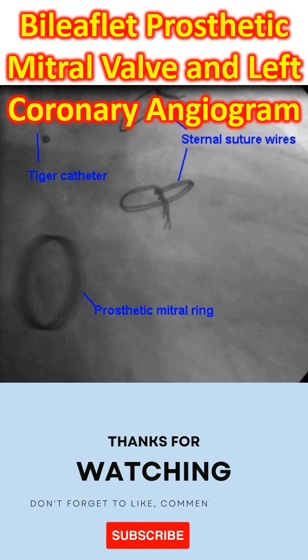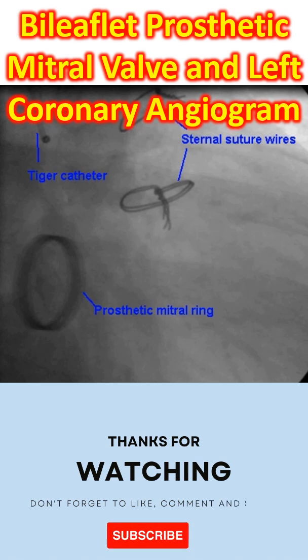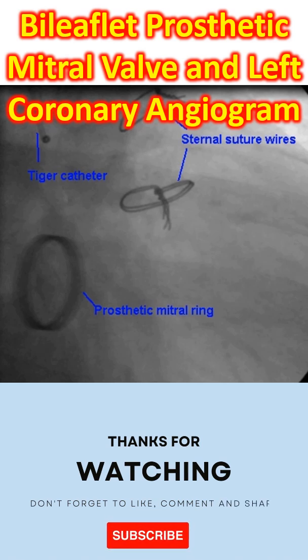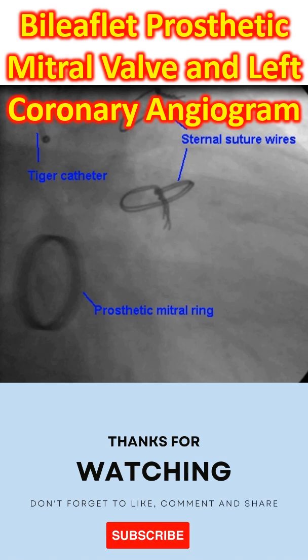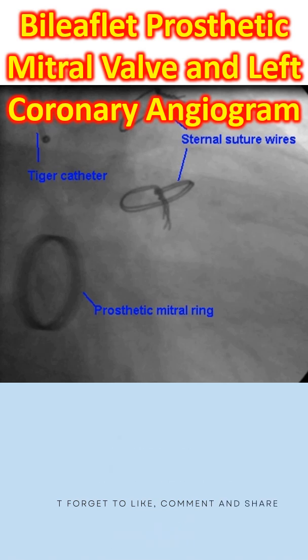Since this is a post-surgical patient, sternal suture wires are also seen in the background.